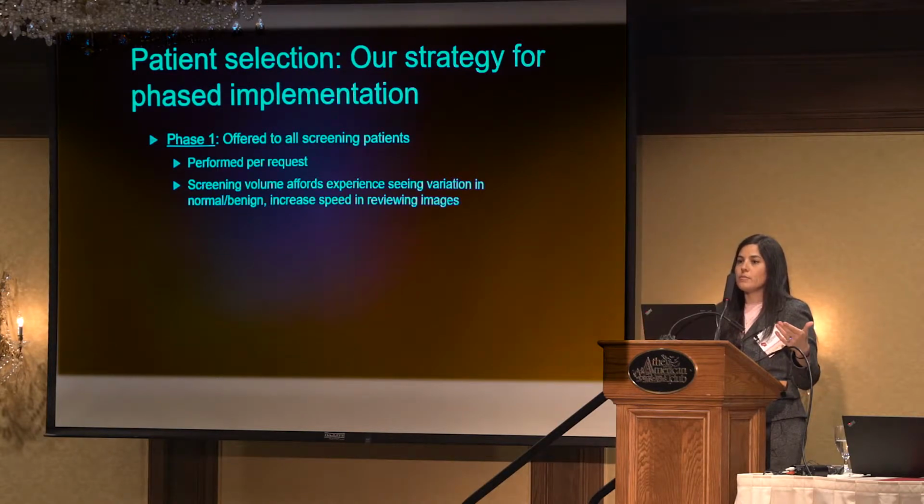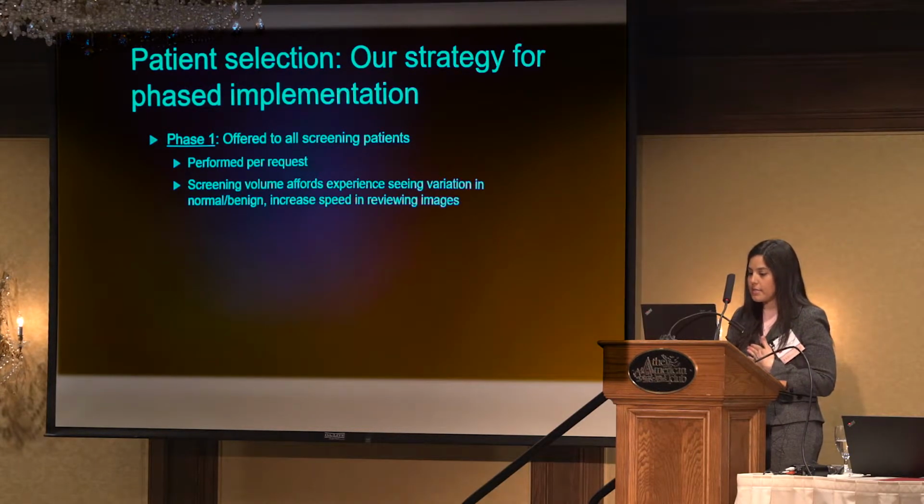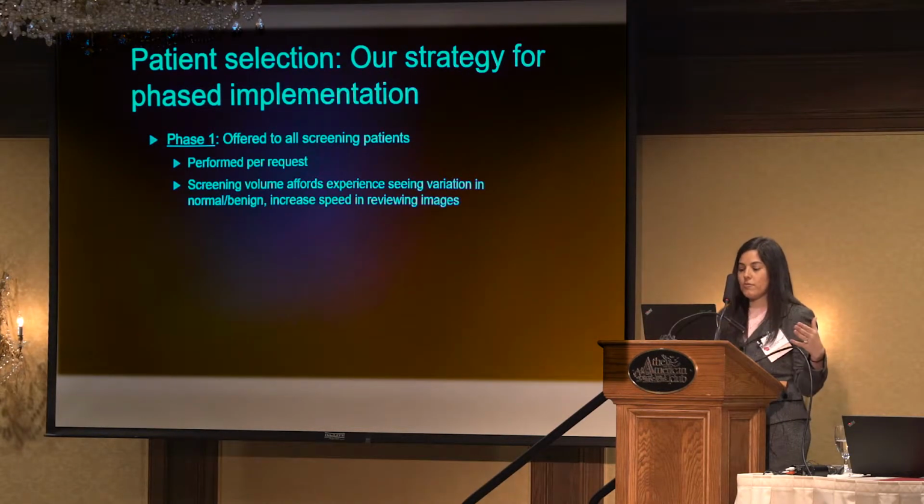So not recalling women for additional imaging is really only going to be beneficial in the screening setting, the way that we practice. We also felt like getting the screening volume would allow the radiologist to see the variation in normal and benign, kind of learn tomosynthesis, and increase our speed at reviewing the images. So it was offered to all patients, and it was performed by a patient request, essentially.